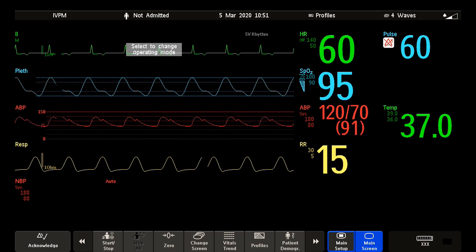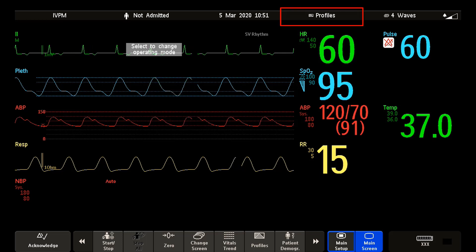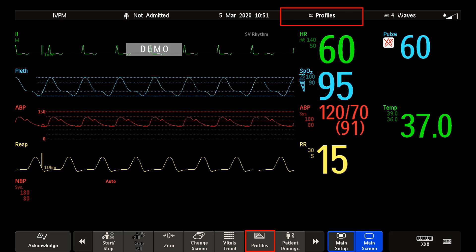To view profiles in your monitor, select profiles in the monitor info line or select the profile smart key.